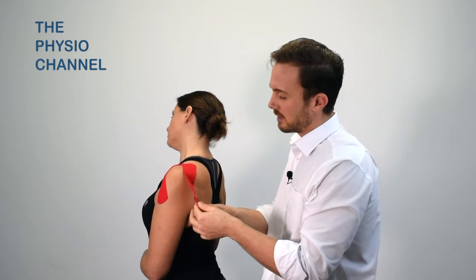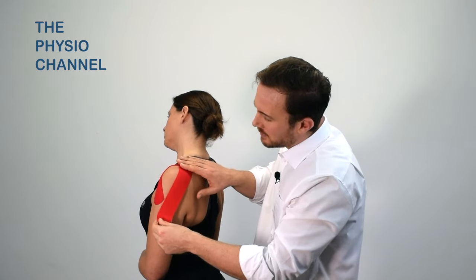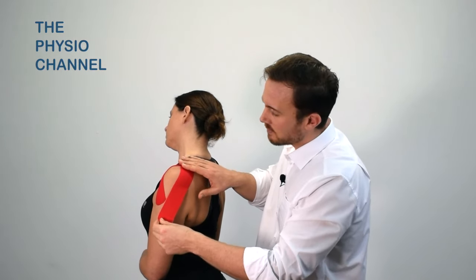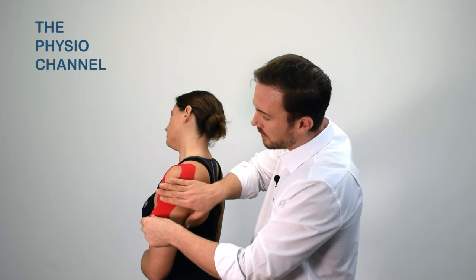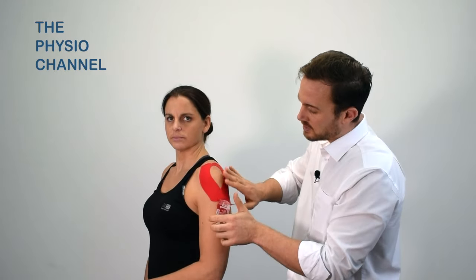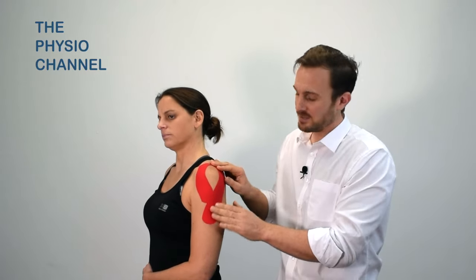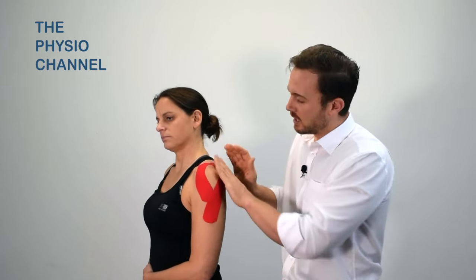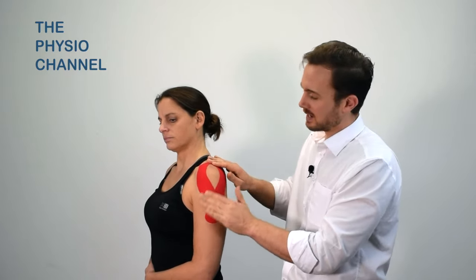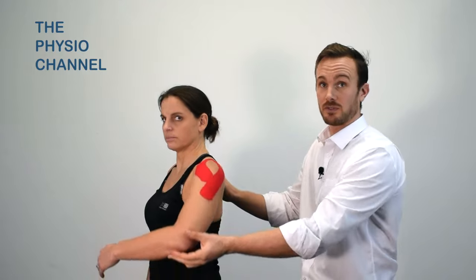Peel away the backing paper, which gives you the ability to stretch the tape, and then wrap the tape around the posterior humerus, around the posterior deltoid, and finish off over the deltoid tuberosity region. You'll also end up finishing by covering over the end of the first tape, which reduces loose tape ends and makes it stay in place for longer — it also makes it look a bit more aesthetic.